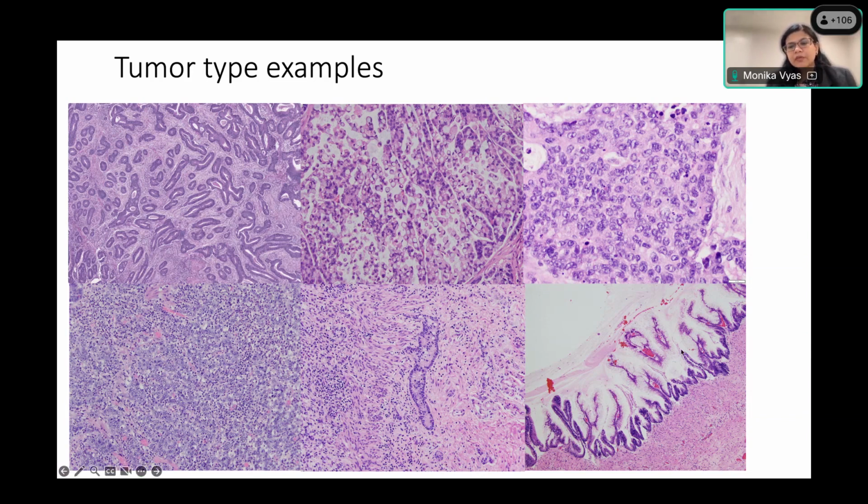And here we have a low-grade mucinous neoplasm of the appendix. You can see a very undulating surface. It is a low-grade dysplastic mucinous epithelium, and you can see that the bases of these glands are directly sitting on the muscle layer. So the lamina propria and muscularis mucosae is completely obliterated, and submucosa is completely obliterated due to pushing invasion of this neoplasm. So here are some examples.